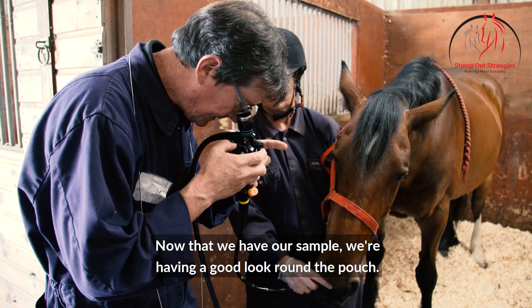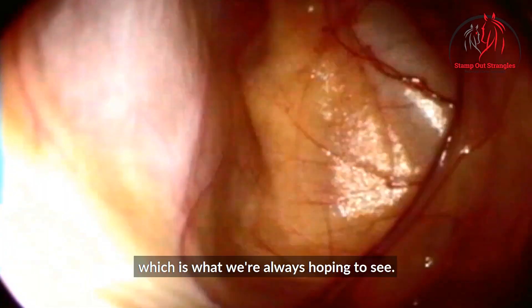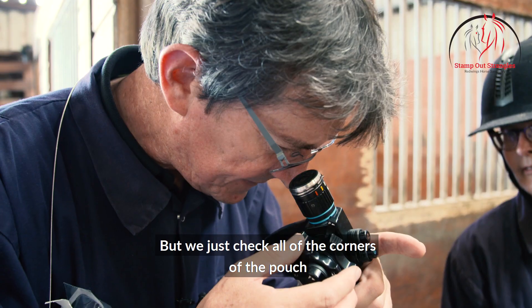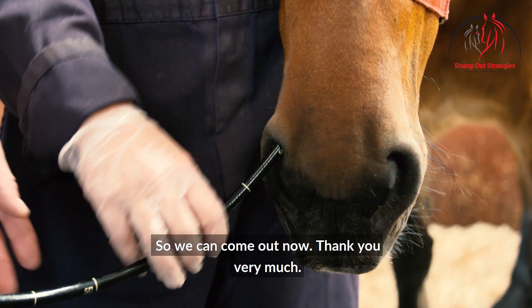Now that we have our sample we're having a good look around the pouch. The pouch looks nice and clean and healthy, which is what we're always hoping to see, but we just check all of the corners of the pouch to make sure that there are no surprises, so we can come out now.